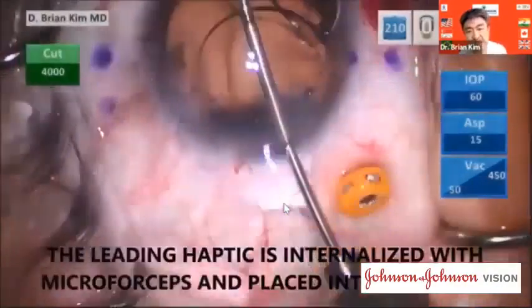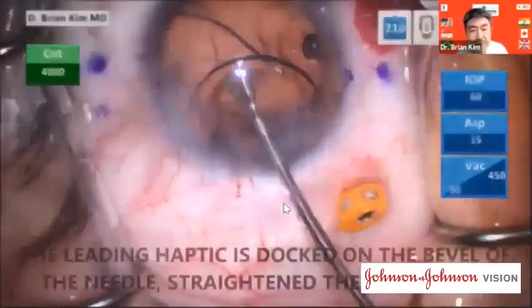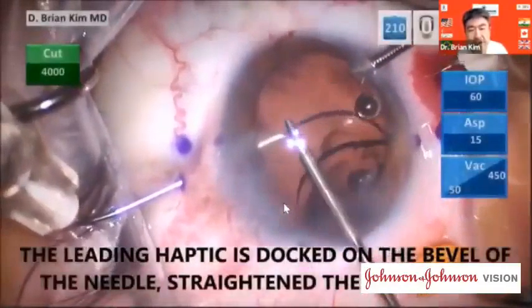The leading haptic is internalized with microforceps and placed into the angle. And the leading haptic is docked on the bevel of the needle, straightened, and then advanced.